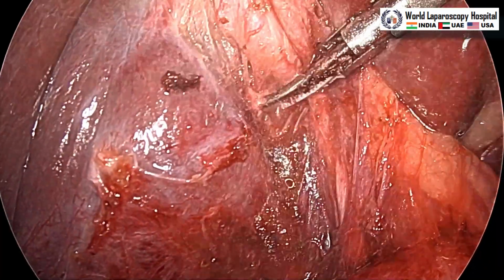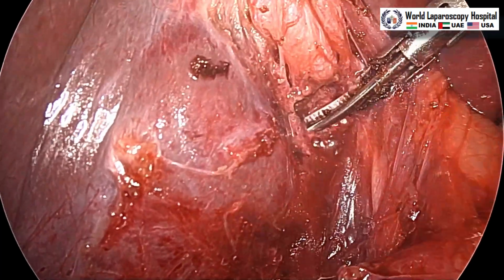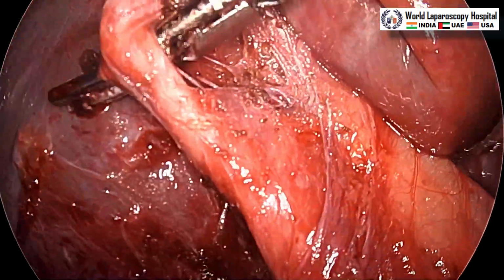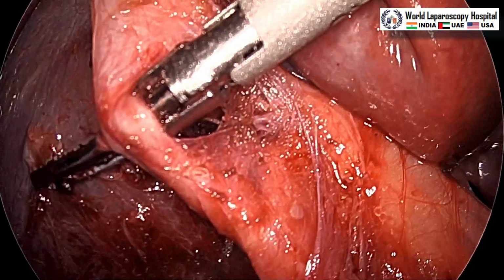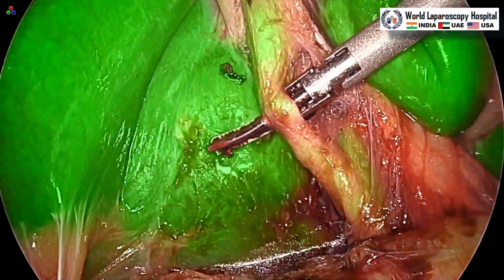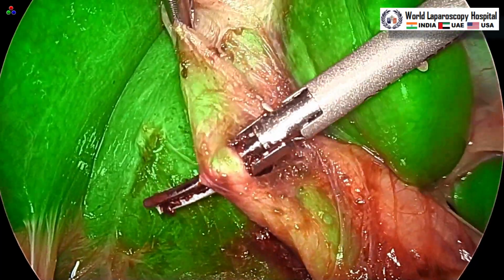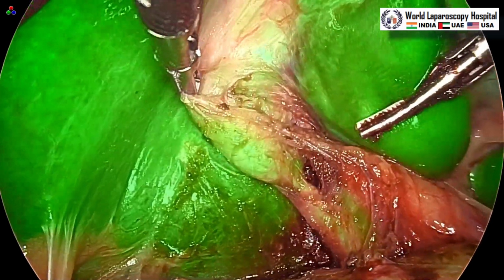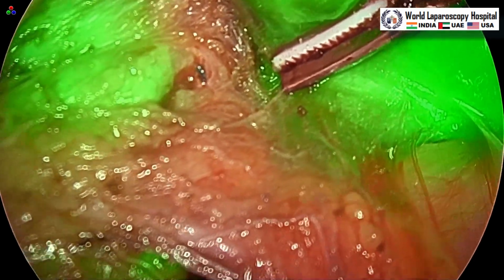A little bit more enlargement of the posterior window can be performed, so that you can see both the windows properly. And now this is the anterior window. After that, you can turn the ICG mode on again to confirm that Calot's triangle and the critical view of safety can be found. So, this is again ICG mode. You can clearly see the CBD and this is the cystic duct, and above we can see the common hepatic duct is also visible. This is the cystic duct, this is CBD, this is the common hepatic duct, and if you put the telescope a little in, then the right and left hepatic ducts are also visible.